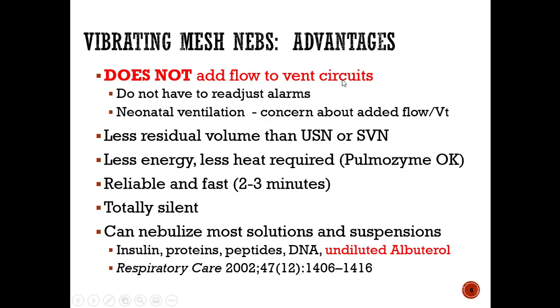And the reason it doesn't add flow is that vibration of the mesh is actually how you're getting that neb to aerosolize. Whereas when you think about your small volume neb, you're hooking it up to 8 liters of flow, right?